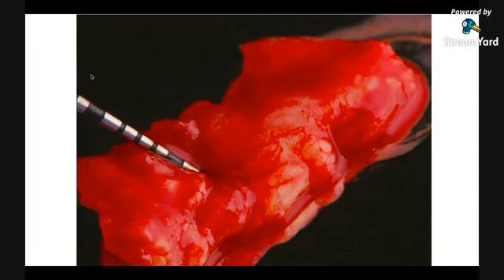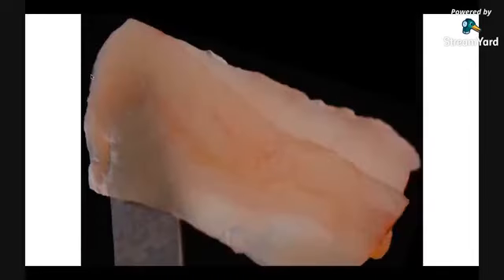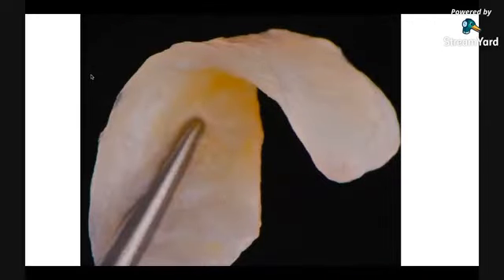It's a lot of blood there. And this is the difference between grabbing and taking a free gingival graft. You can manage the thickness of that graft better. Here you can cut the epithelium and have a nice piece of connective tissue.